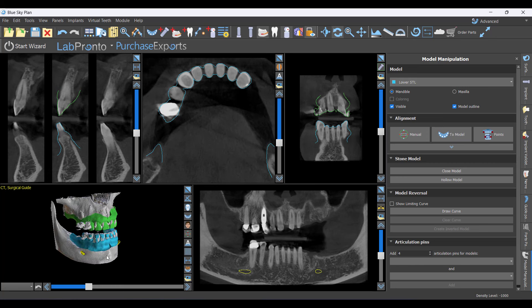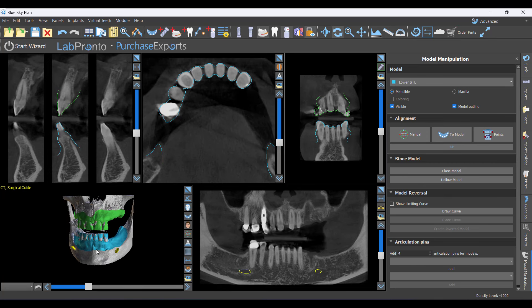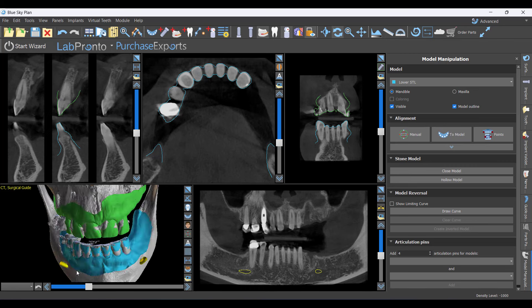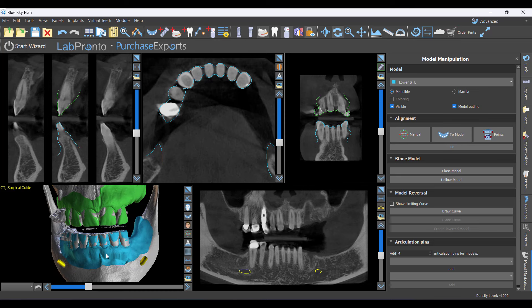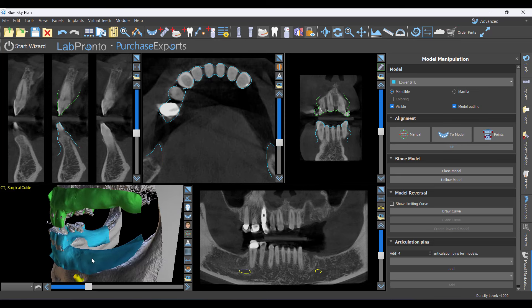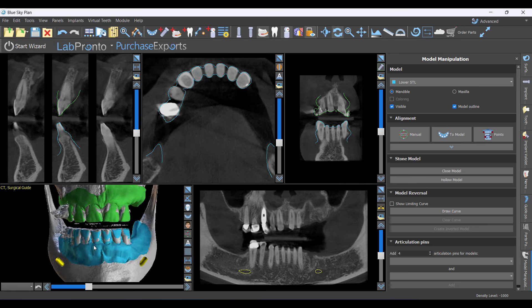We'd now be ready to place implants, but how do you know you're placing them in the right place prosthetically? You've always got to do your prosthetic wax-up first. If it were just a single premolar you might not need a full wax-up, but the more teeth that are missing — and here we're missing entire quadrants — guessing is not a good approach. Figure out where the teeth belong, then plan the implants backwards from that.